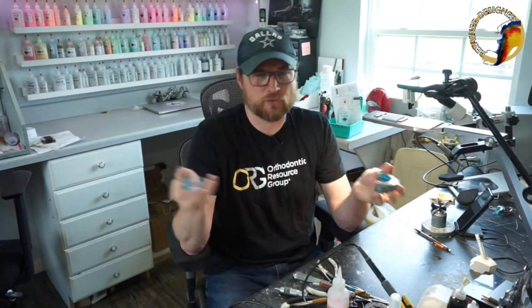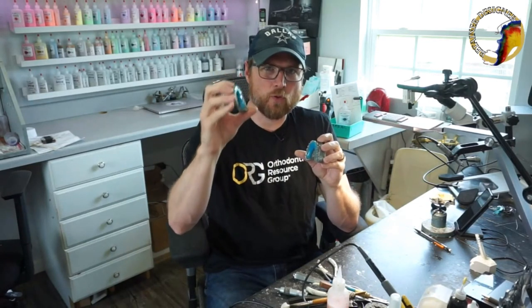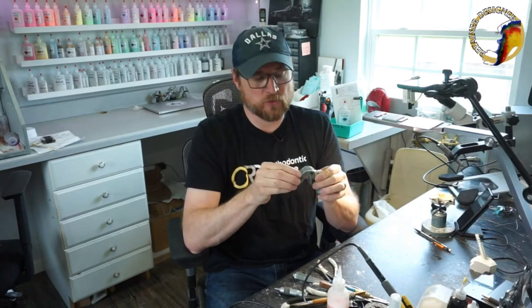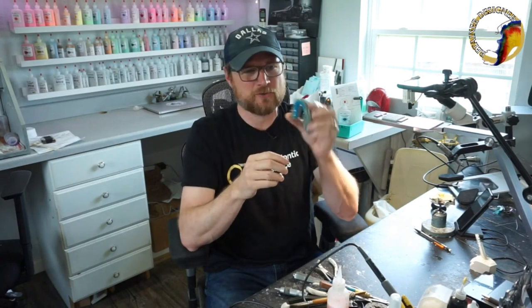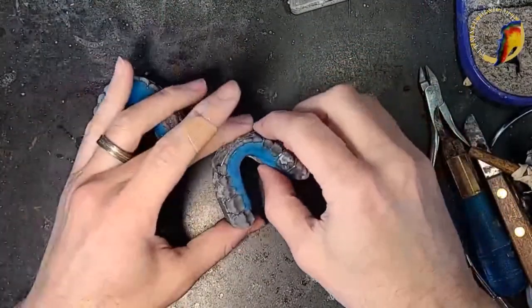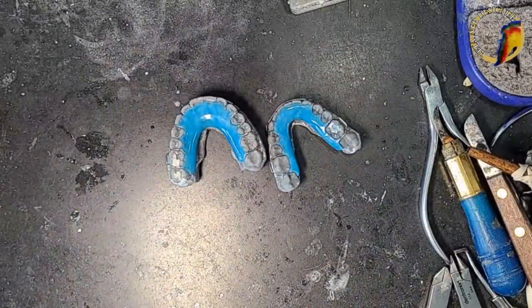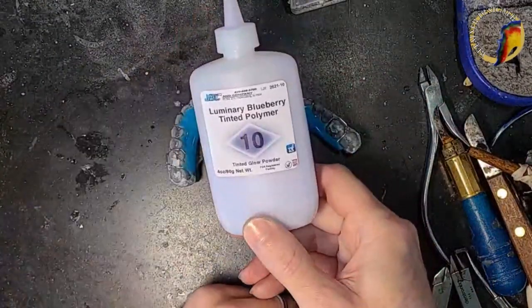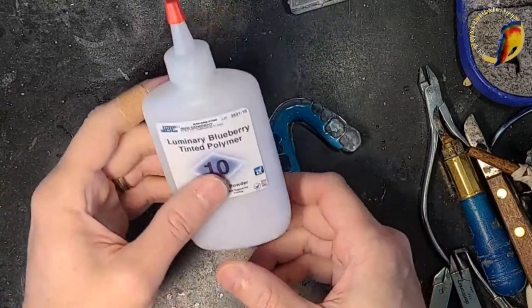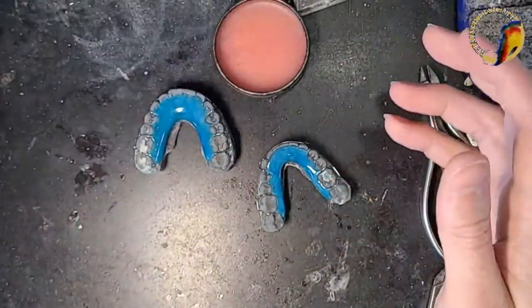I'll show you my little trick for removing the acrylic safely without damaging the wires. I wanted the wires back so I don't have to re-bend them — that saves time. These are the two retainers; they are luminary blue. They want to change them to luminary blueberry, which is a little more purple.